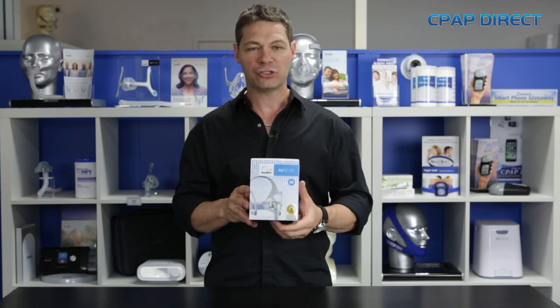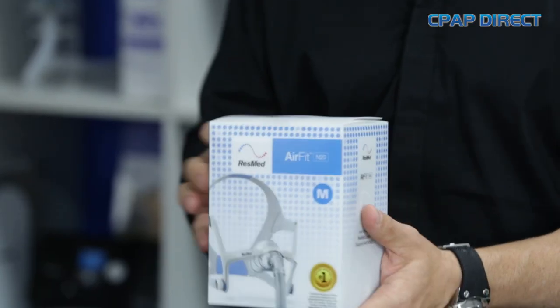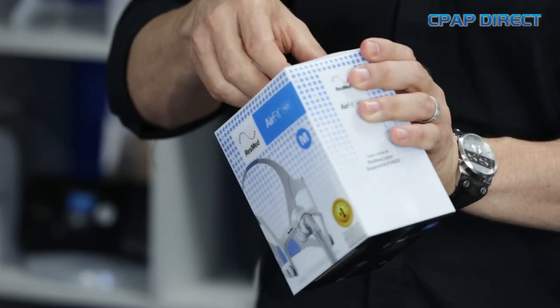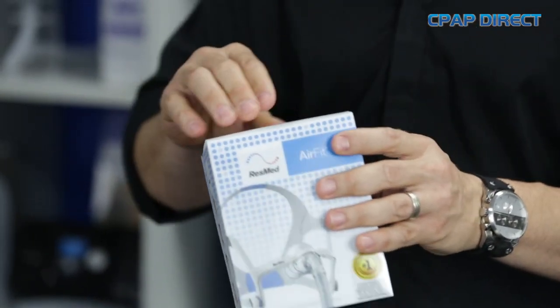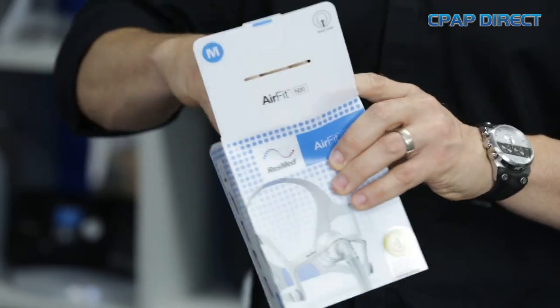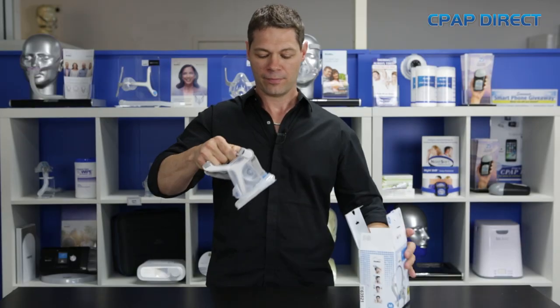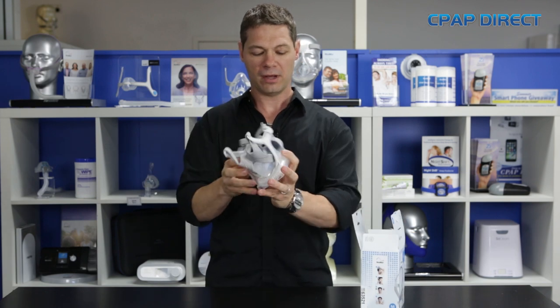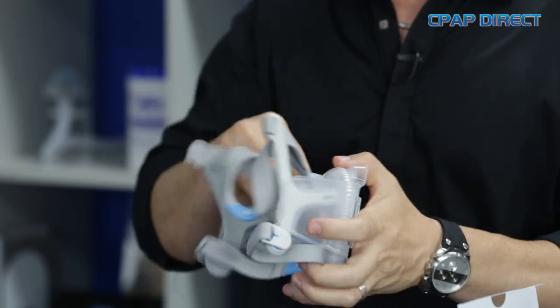They've got the seal really, really well. I'm going to show you how this mask looks. When you get an N20 mask, it should come in a box like this. If it doesn't, then you've got a copy or an inferior product. They've put a lot of time and effort into designing the box, a bit like Apple do with their products as well. So it opens up quite nicely, and out comes the mask. Very well packaged.